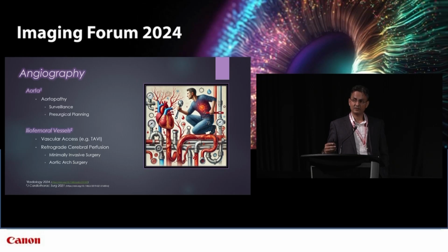With the growth in minimally invasive surgeries across the board, no different in cardiac surgery, there is the need for retrograde cerebral perfusion. And it's actually fascinating when we started getting referrals for this. It wasn't clear to me exactly what they were looking for because we'd come out of the TAVI world and we were measuring luminal diameters to tell them all these things. They said, oh, no, we don't need to know that. Well, they sort of need to know that, but what was more relevant to them was plaque burden and tortuosity.